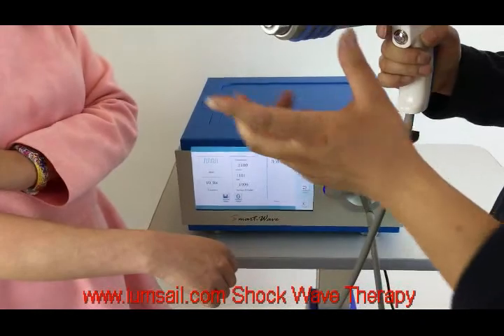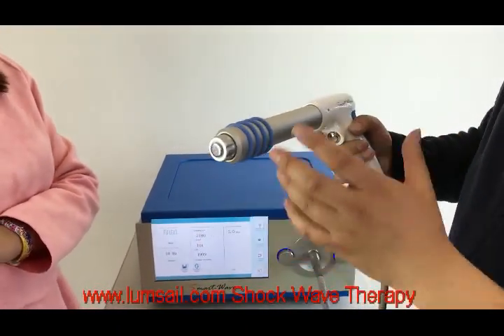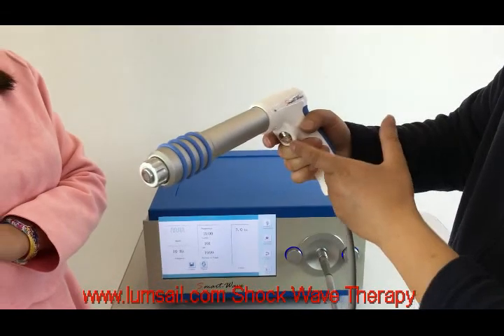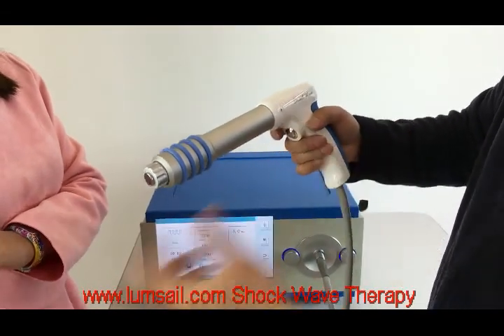If you press down the trigger button a little bit, it will shoot as you press down the trigger button. If you press down the trigger button heavily, it will go into continuous mode.